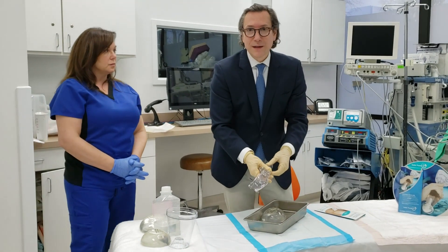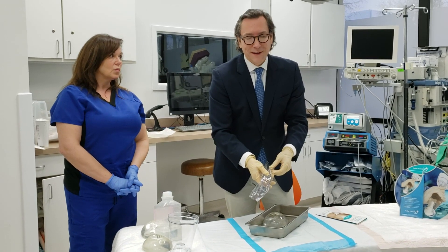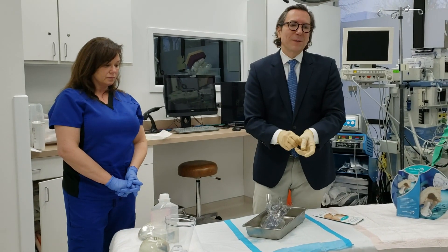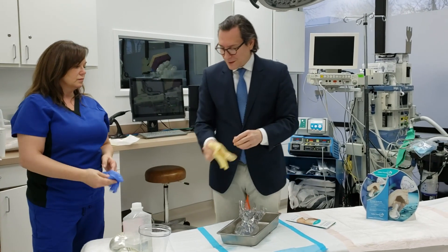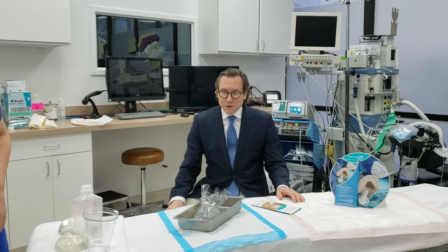Once the implant is in, you can go ahead and start closing, or go to the other side and do the same thing, and then start closing. The Keller Funnel over the years has become almost routine for me in not only cosmetic breast implantation surgery, but for reconstructive surgery.